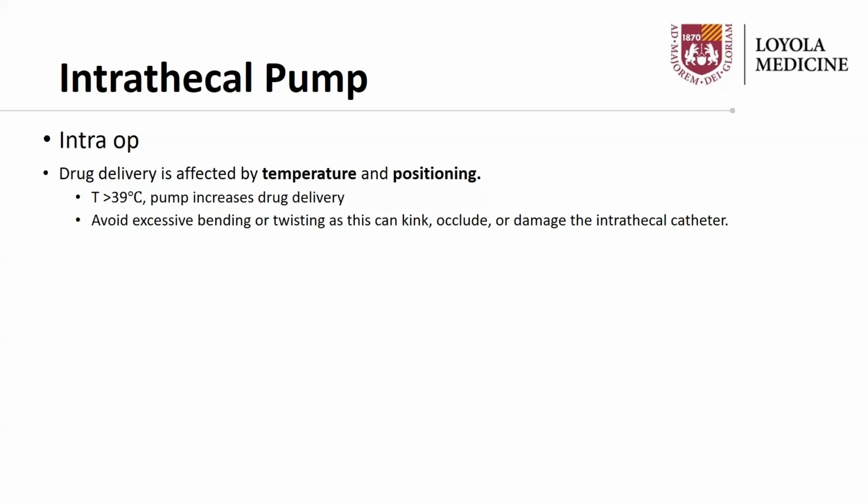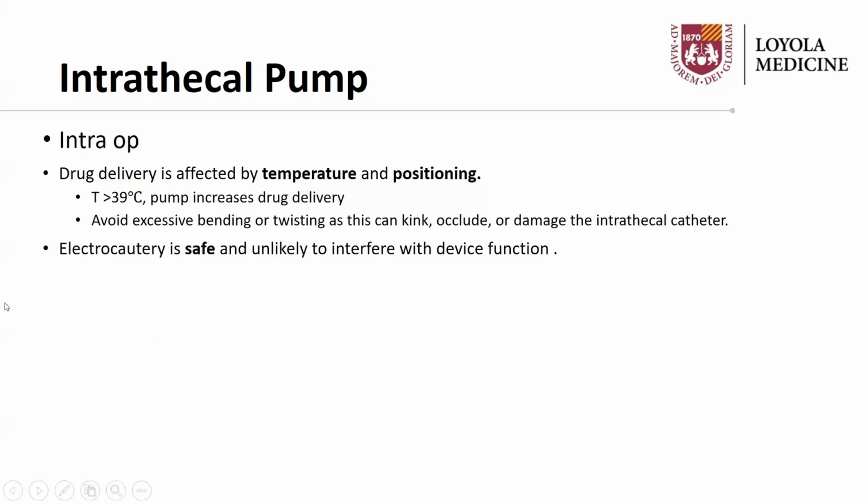Also, when positioning, avoid excessive twisting or bending, as these can kink, occlude, or damage the intrathecal catheter.